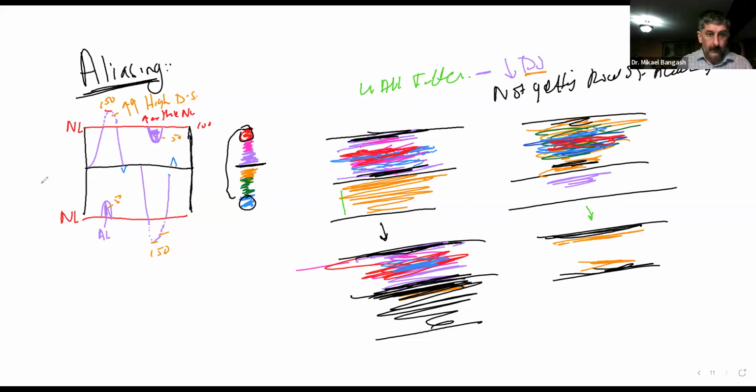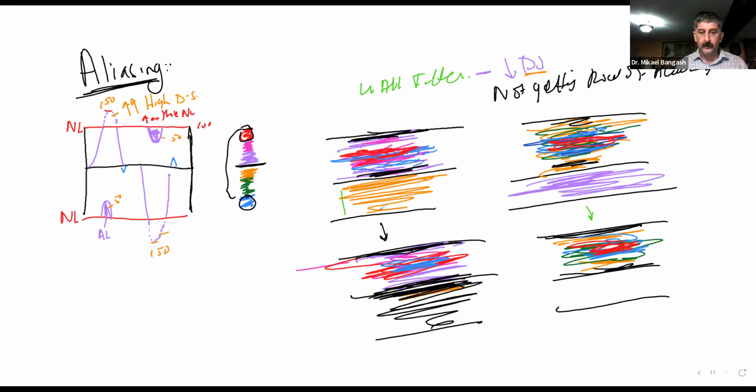Those velocities will still be there, and you will still have your aliasing. But the lower blood vessel should have been more filled out, but let's just say it may get like this, but it does not get rid of aliasing. Did you guys get that?